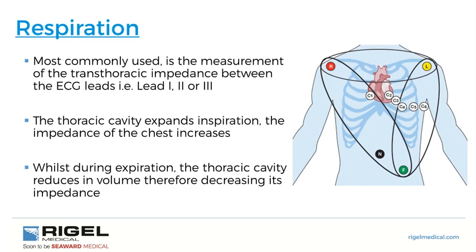Typically lead 1 and lead 2 are changed, where you might have, as far as the simulator is concerned, 500, 1000 ohms, and then the breathing rates or the respiratory rates are the delta resistance, which is the change in resistance, which is very small changes, typically half an ohm or 1 ohm.